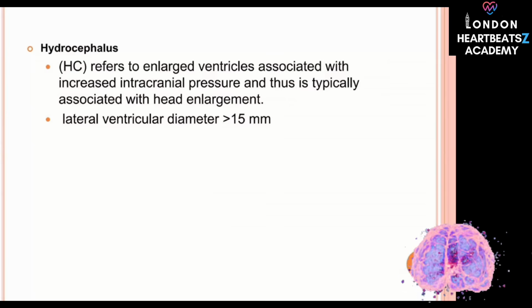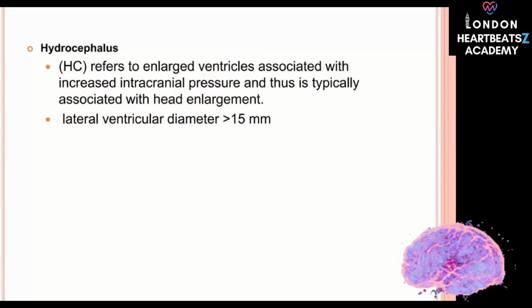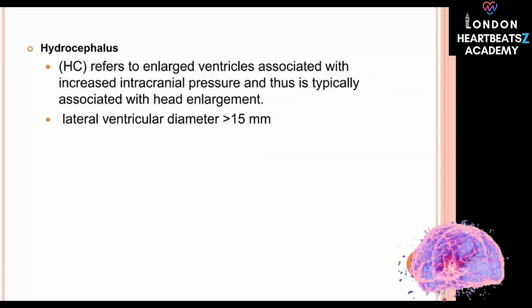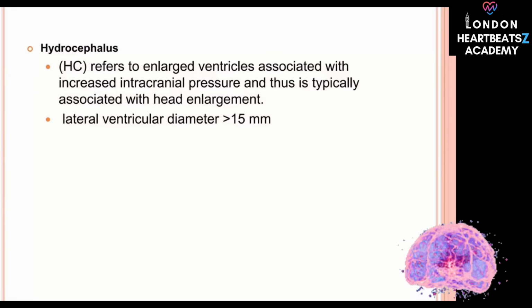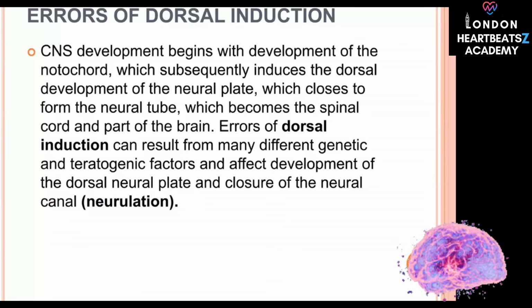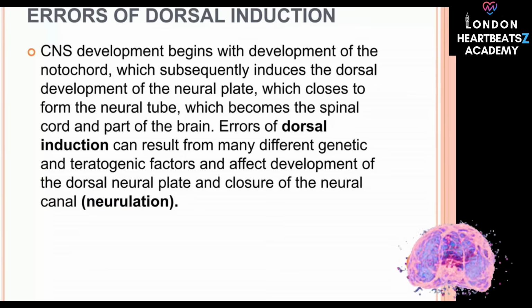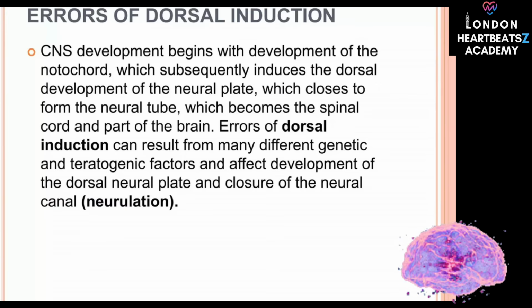Greater than 15 millimeters, so a higher threshold. Exactly. It indicates more significant enlargement. This measurement technique and the distinction are pretty consistent with how hydrocephalus is assessed even after birth. Sources on neonatal cranial ultrasound also describe measurement indices, like the Levene index, to quantify ventricular size in newborns, showing a continuity of assessment from fetus to infancy. That connection to neonatal assessment is interesting. Makes sense they use similar approaches.